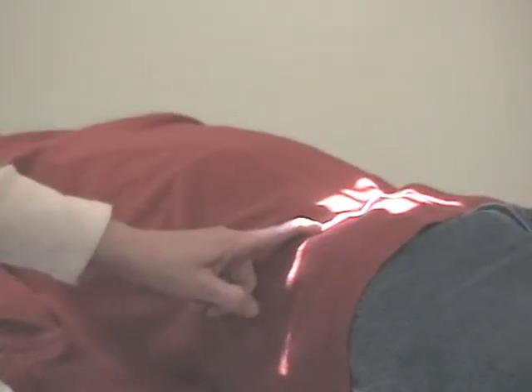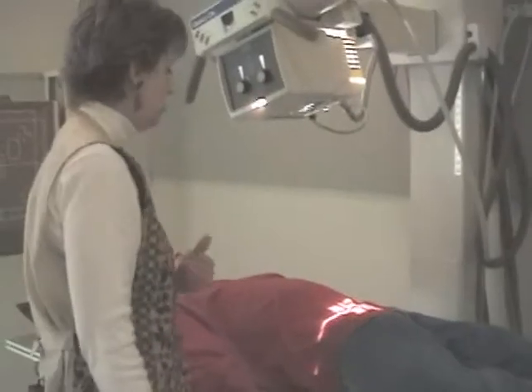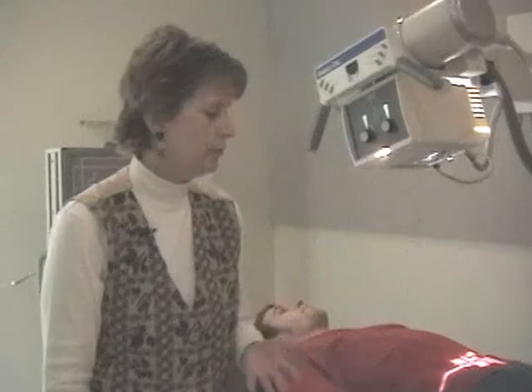And now find the ASIS right here. And the central ray enters at the level of the ASIS, exiting to the center of the film. Patient is not rotated. MSP's to the center. ASIS exiting to the center of the film. You can make your exposure. Patient takes a breath in, blows the breath out. Don't breathe, don't move, make your exposure.